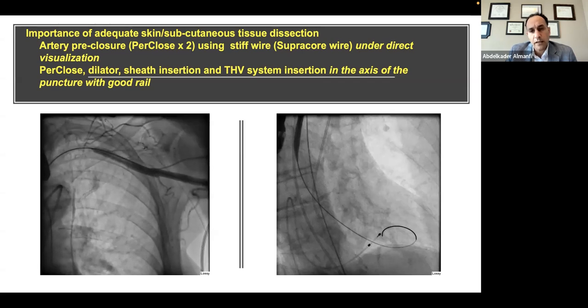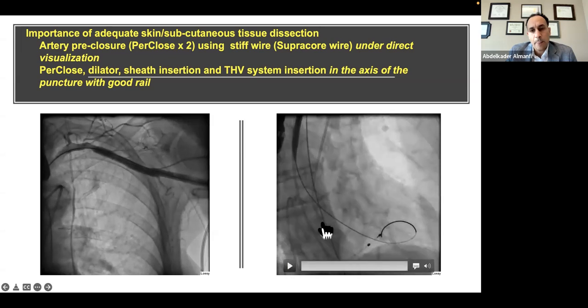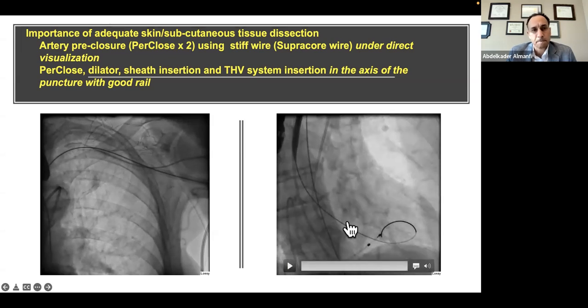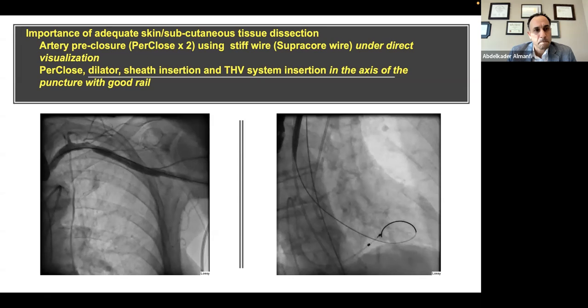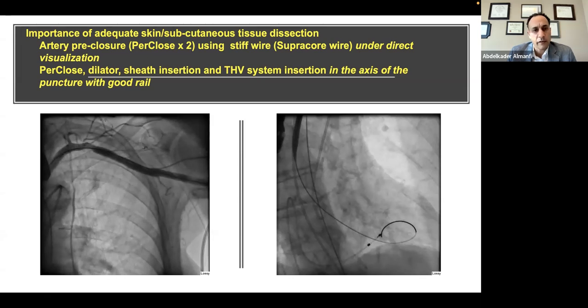We always obtain a view where we can advance the double pre-close technique to secure the axillary access. Next, we cross the valve in the same fashion using an AL1 catheter and place a Lunderquist coarse wire in the ventricle — the same usual fashion as the femoral approach. We then advance the dilator over the stiff wire to obtain a track and a good rail to advance the valve.